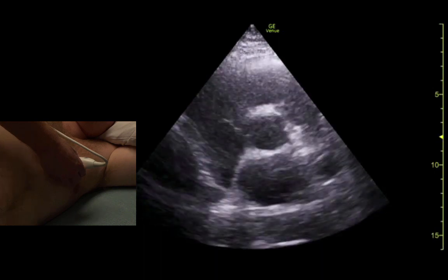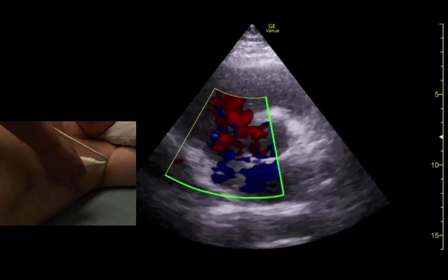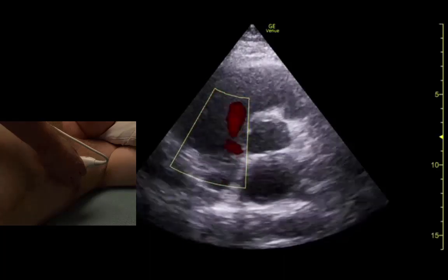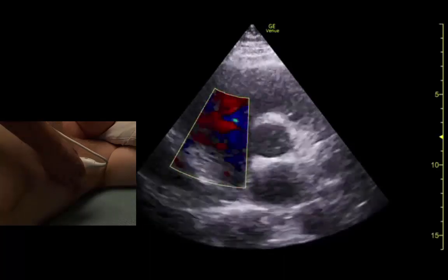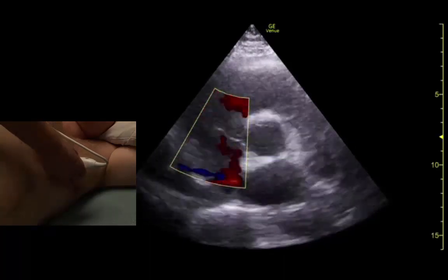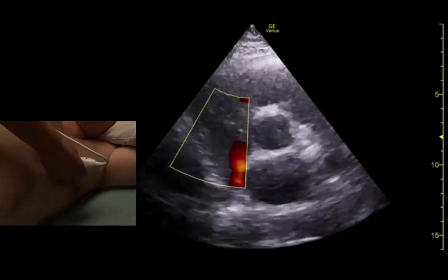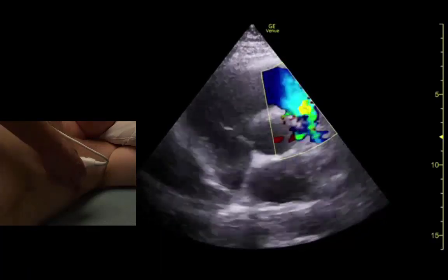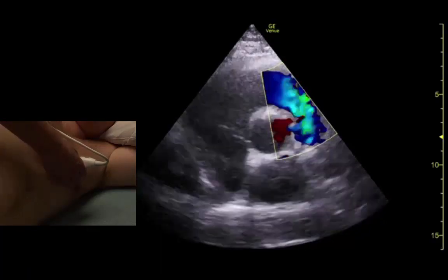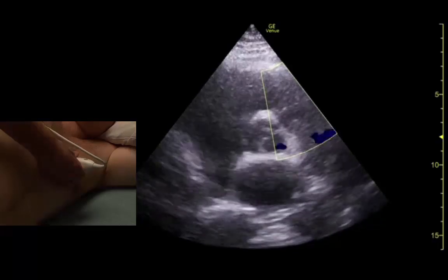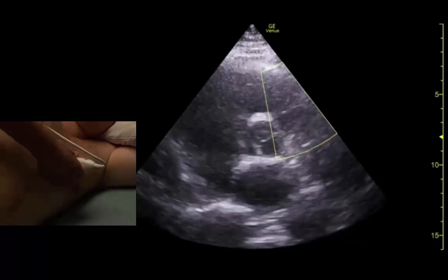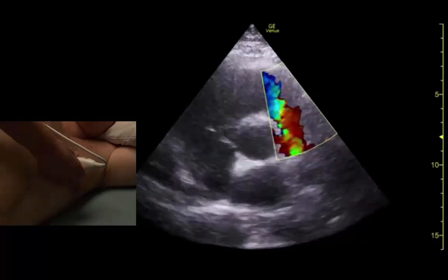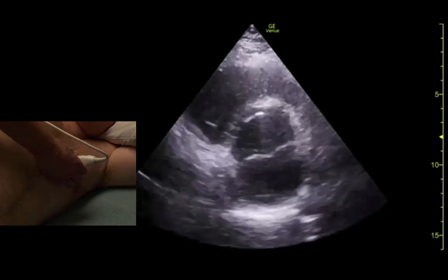Let's put color on those. Blood flow should all be red coming towards our transducer on this side, and all blue over here on the other side. There it is.